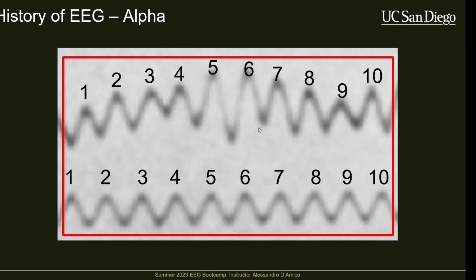And there are tons and tons of oscillations, and in general, we don't talk about alpha as being specifically 10 hertz, but alpha is widely regarded to be around 10 hertz. All of these oscillations are in a range. This range is different depending on the activity that you're recording, the individual you're recording from, the equipment you're using, all of that. But alpha oscillations are very reliably recorded.